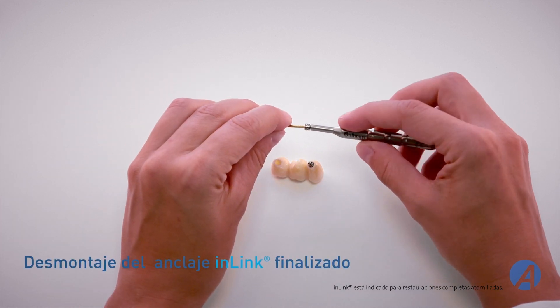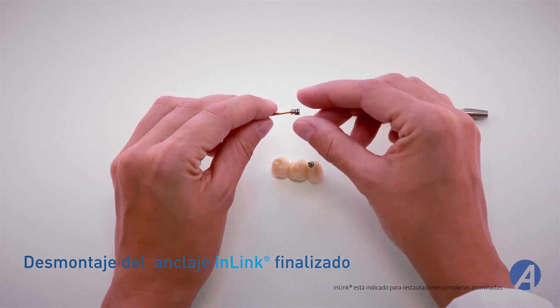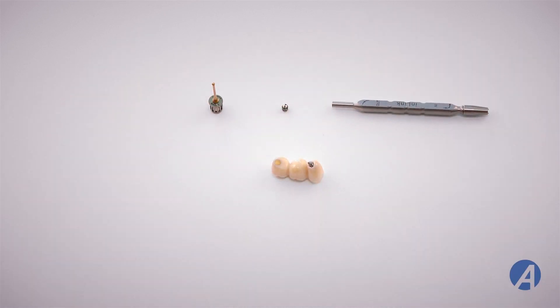Extraiga el anclaje de la llave in-link con la llave esférica dorada. El anclaje y su anilla están ahora desmontados de la prótesis.